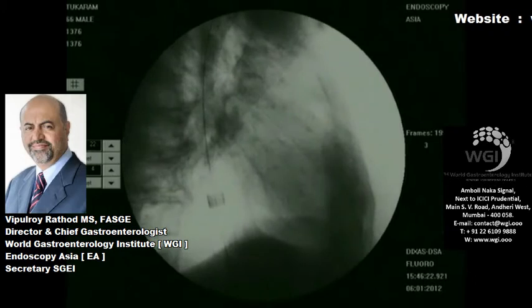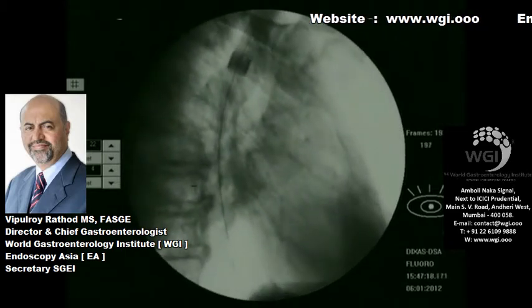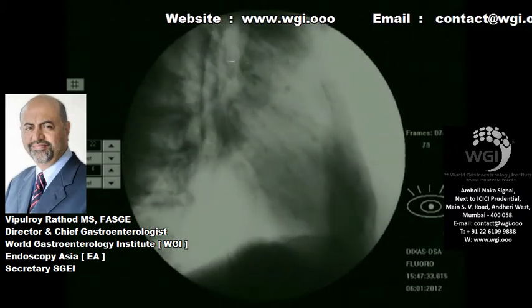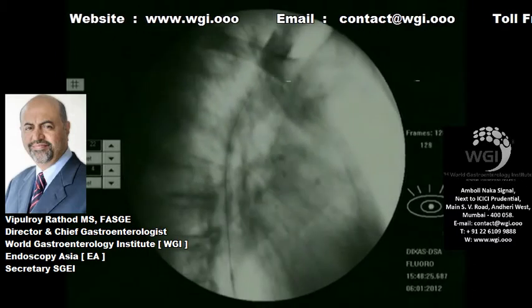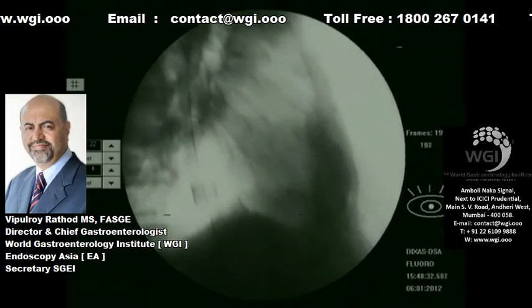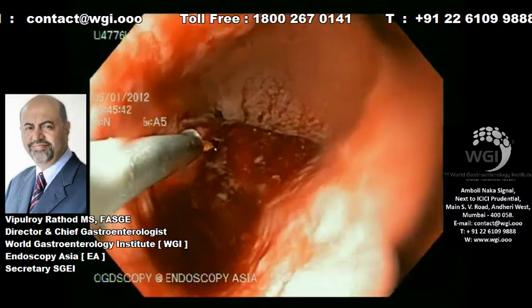Very gently we push across the stricture. We usually do not follow the rule of three, but for beginners they should — we started with a 9 mm, then advanced to an 11 mm dilator as you can see here, and then subsequently dilated up to 12.8 mm. We usually dilate up to 12.8 mm because we want to pass our scope across to see the extent of the stricture.